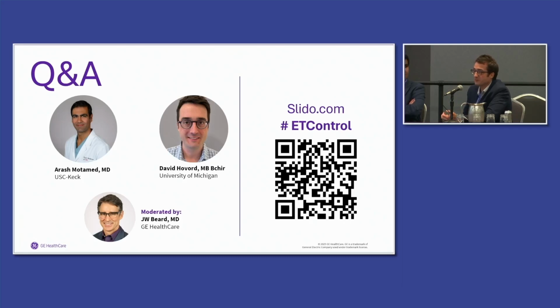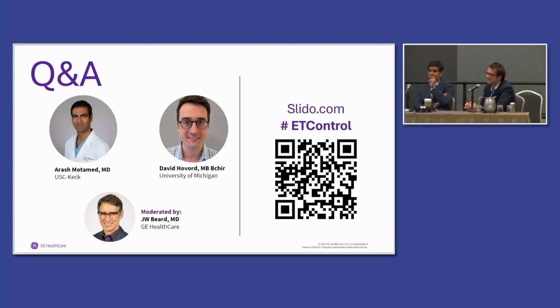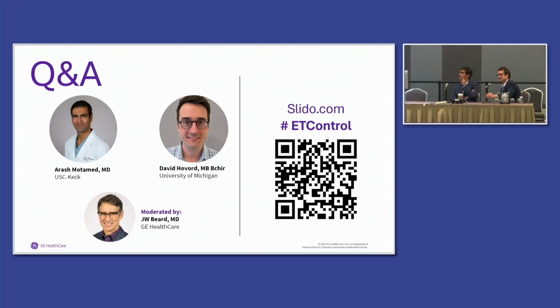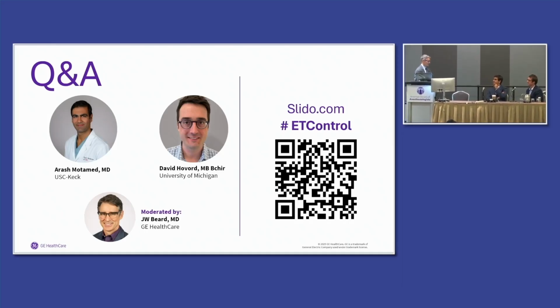And one of the things that I wish that you could have and one of the things that we're going to implement in our EMR is that as soon as they hit airway, we're going to put a flag up saying, is end-tidal control switched on? Just little reminders, little hints, little nudges. Most people, there's no kind of resistance to the actual technology itself. When you speak to people, they understand how it works. They get that it's better. Sometimes they just kind of forget. And I think that's probably the slightly unsatisfying answer. No, it's dealing with clinical behaviors and practice patterns and introducing new technology.